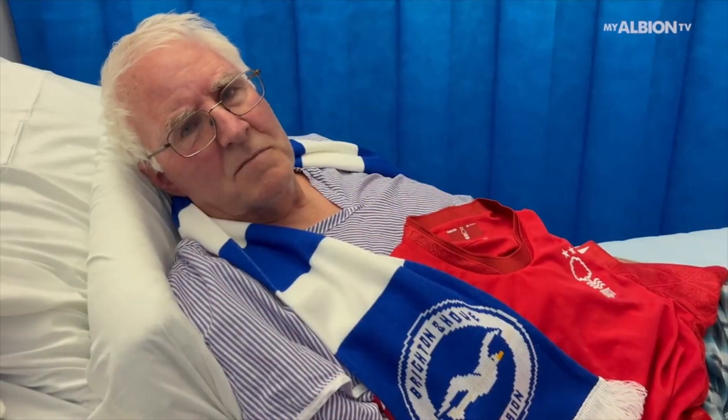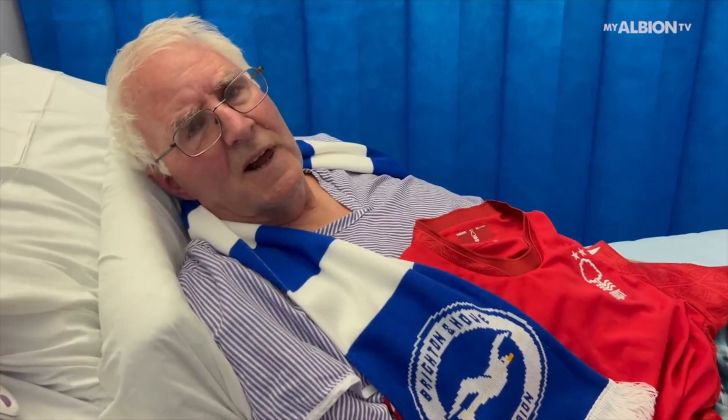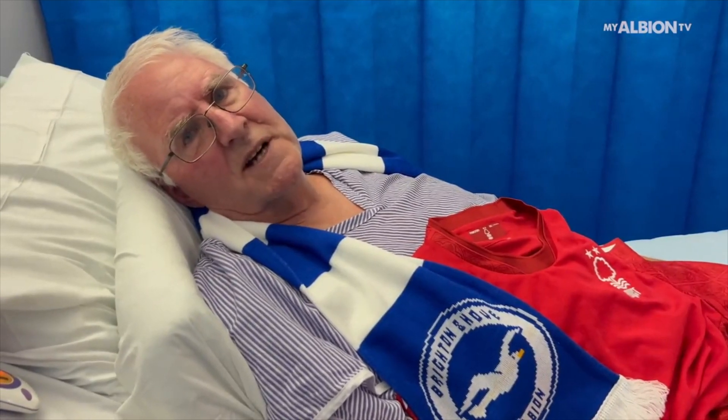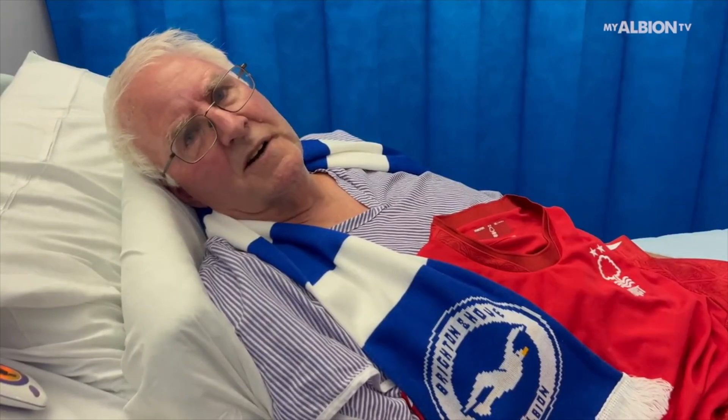I'm Bob Whetton, a big home world first supporter. I went to the game at Brighton last night and unfortunately I didn't make it inside the ground because I had a cardiac arrest.